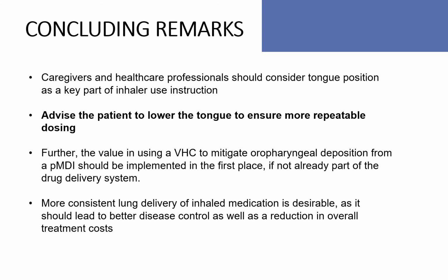So from this, we're hoping that caregivers and healthcare professionals will consider tongue position as a key part of their inhaler use instruction, advising patients to lower the tongue to ensure a more reproducible dose. Furthermore, the value of the VHC has been demonstrated to mitigate oropharyngeal deposition, which should have been implemented in the first place if not already part of the drug delivery system. As more consistent lung delivery of inhaled medications is desirable and should lead to better disease control as well as a reduction in overall treatment costs.